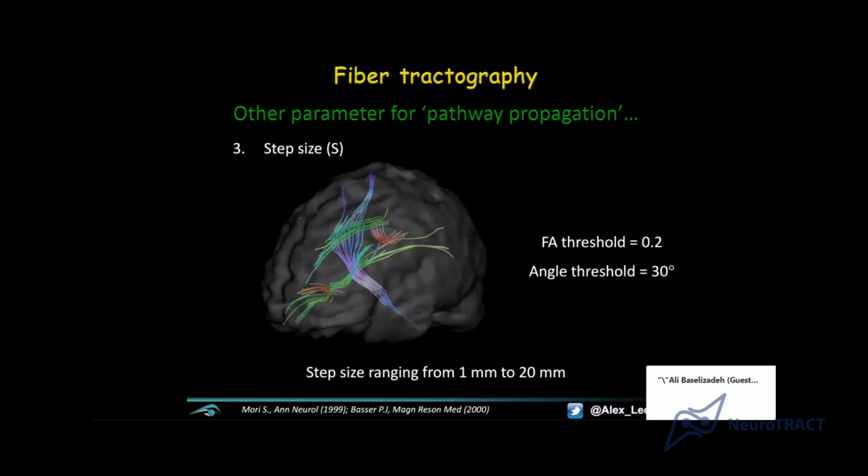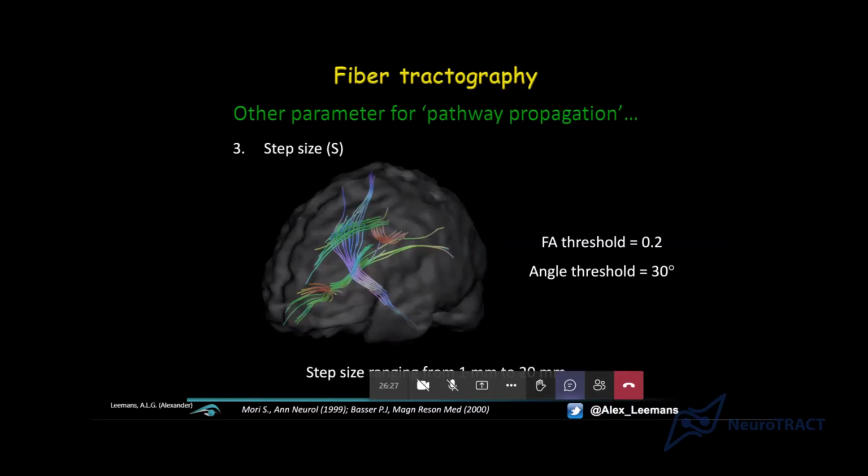It's a fancy word for basically saying, if we have signals at voxels, right? And indeed, you're right. We've got discrete voxels, and let's call them 1 millimeter apart. These voxels have a physical dimension. Think of them as little cubes, and in each little cube, there's a signal. So what is actually located in between the voxels? Well, these voxels represent a data set. They represent a world object.